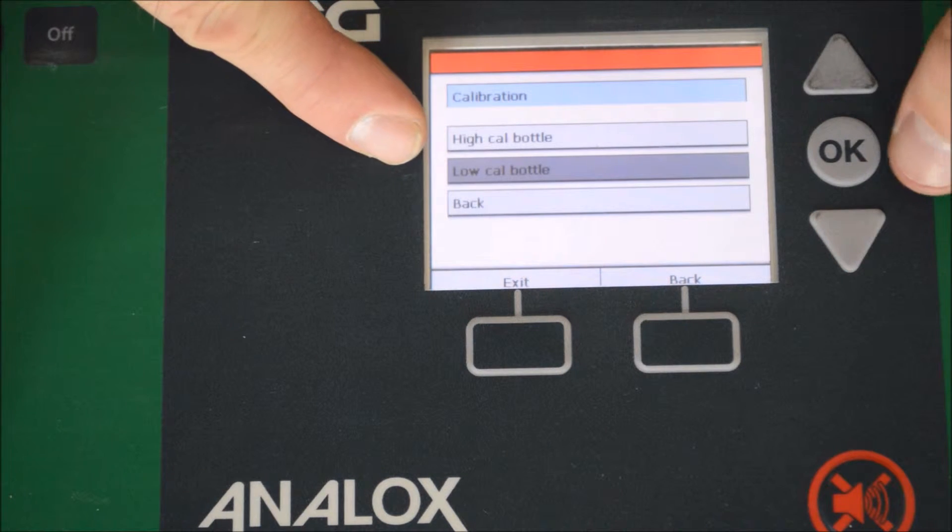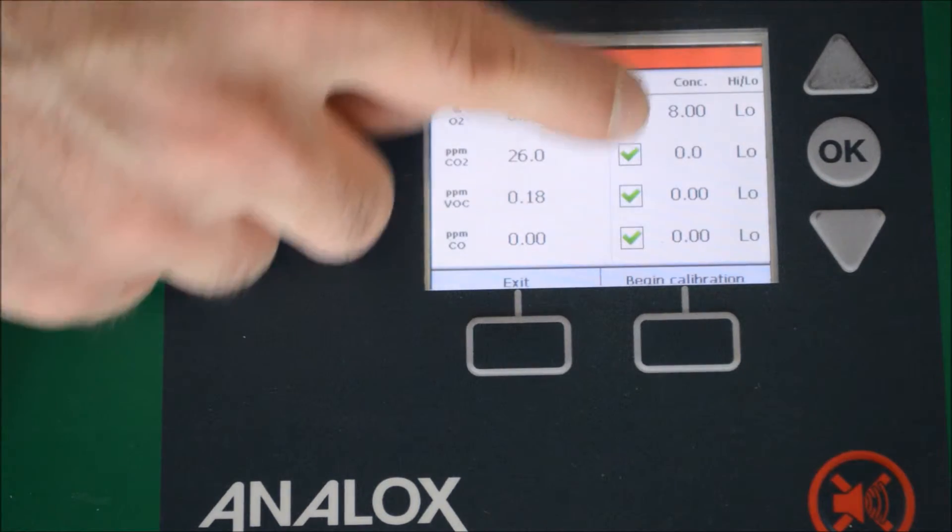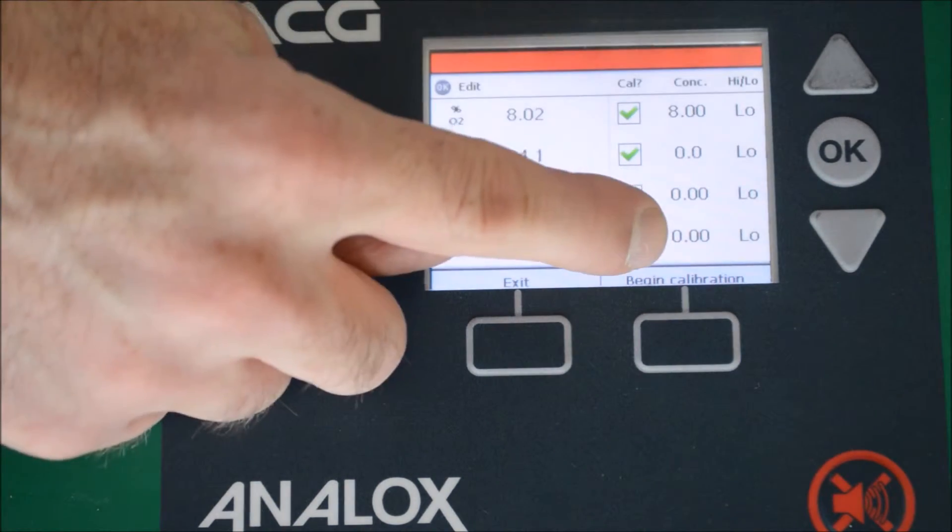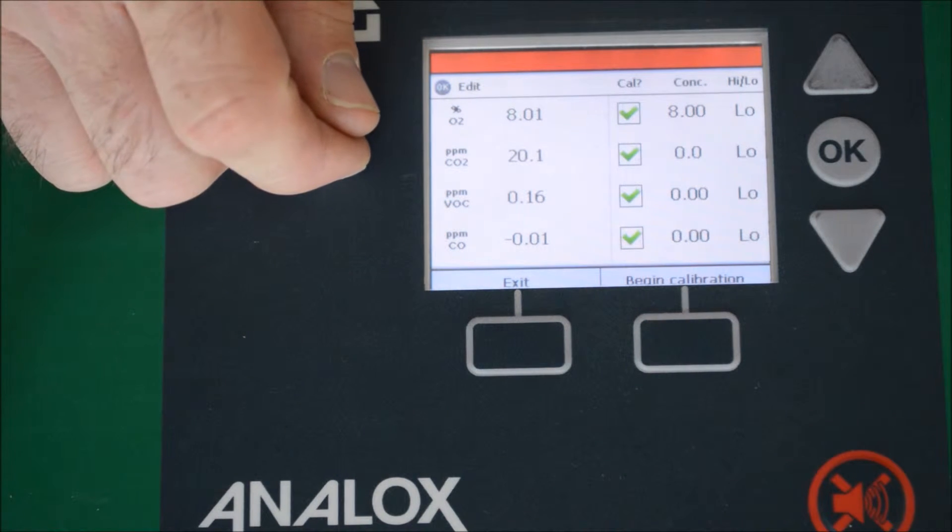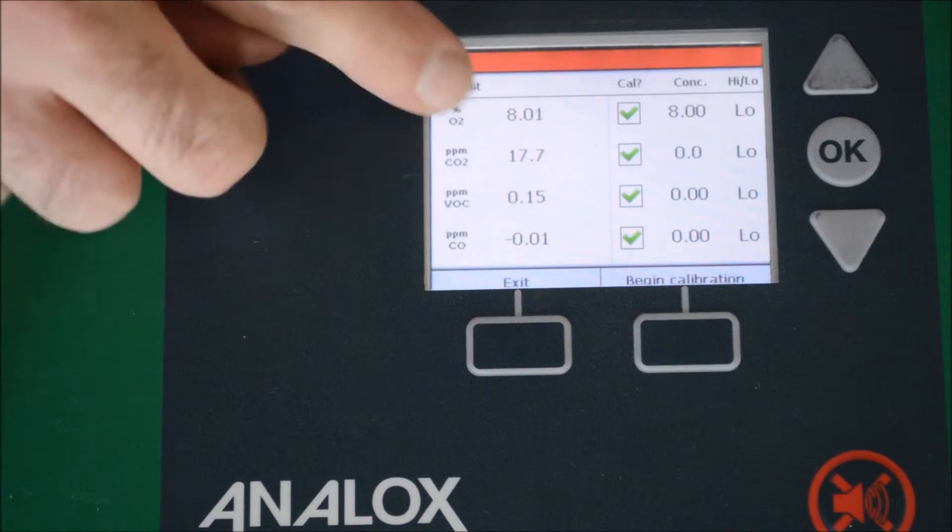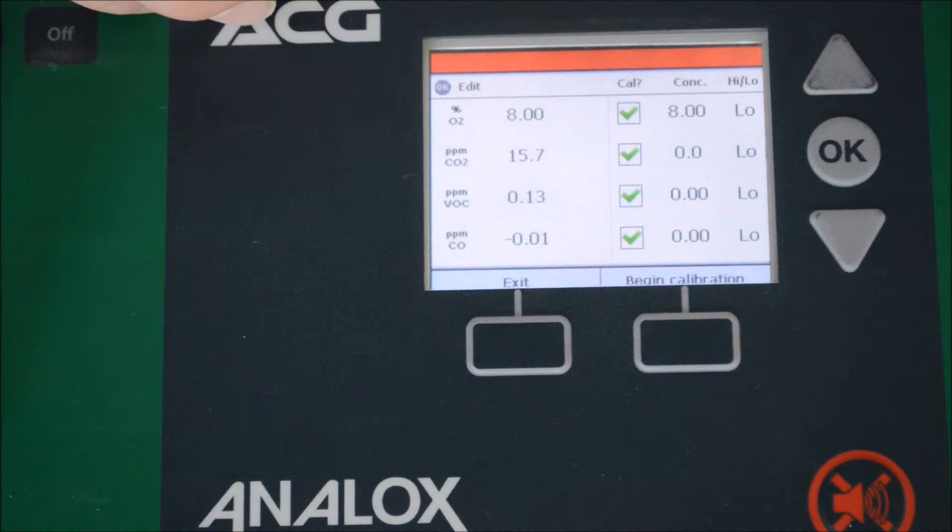We need to check that the calibration concentration, which is on this side, relates to the calibration on our calibration bottle, and these are the live gas readings that we're carrying at the moment. We need to leave the calibration gas running for five minutes to allow all the gas to be purged of the system.